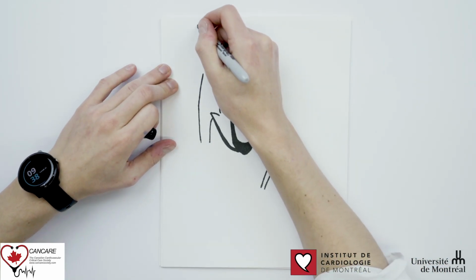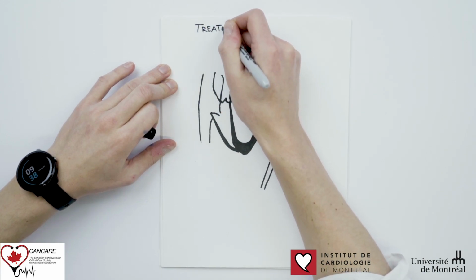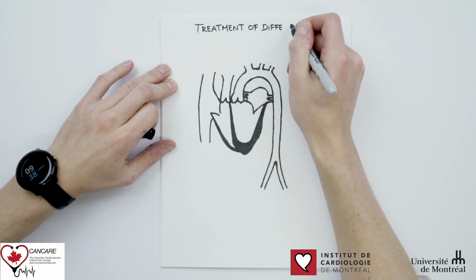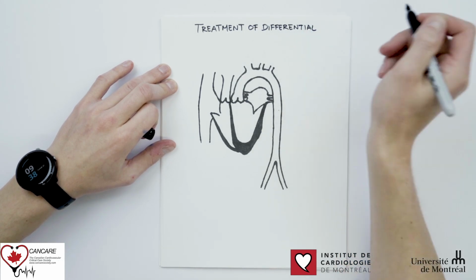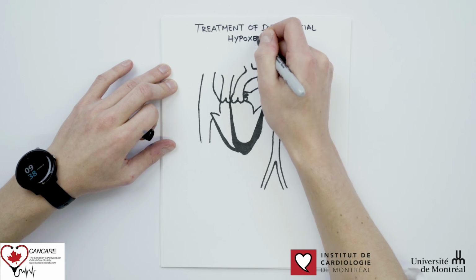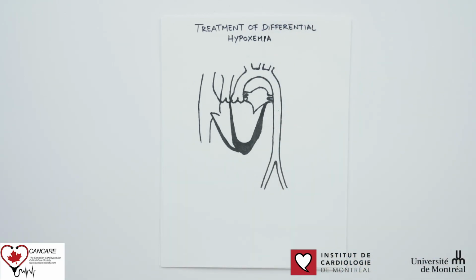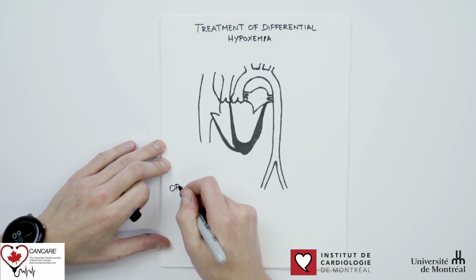Now, focusing on the treatment, the problem with differential hypoxemia lies in the fact that the left ventricle is ejecting deoxygenated blood. Therefore, it can be corrected either by increasing the oxygenation of the blood coming through the pulmonary circulation or by decreasing the amount of deoxygenated blood ejected by the left ventricle.